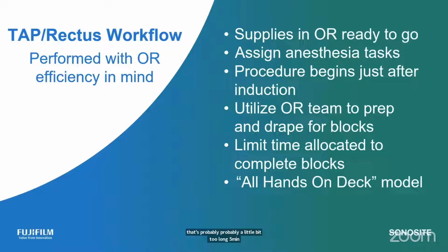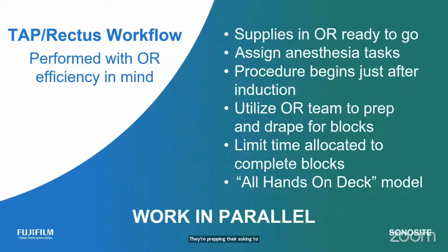But again, it's all hands on deck. Everybody's helping. Everybody's in on what we're doing. And actually, what we've seen is our staff take great pride in helping us. I mean, they started gloving the anesthesia provider on the way around the bed to do the blocks. They're prepping. They're asking to prep. They're all over it. So it's been fun to watch. The idea here is to work in parallel. Two groups working at the same time, performing different tasks so that we cut down on time. It's just trying to be efficient and just using common sense to get the day done a little bit quicker.